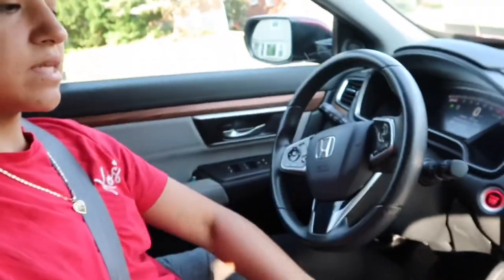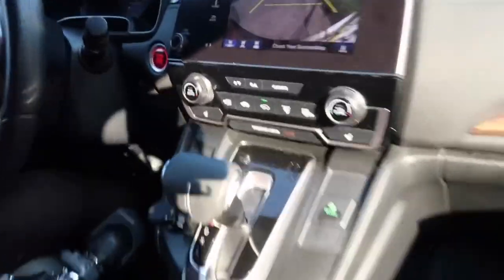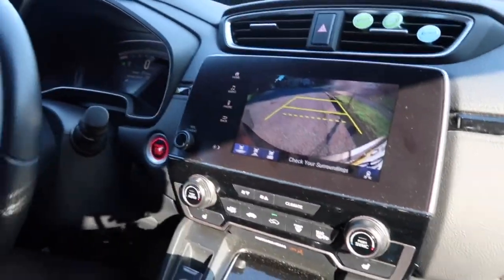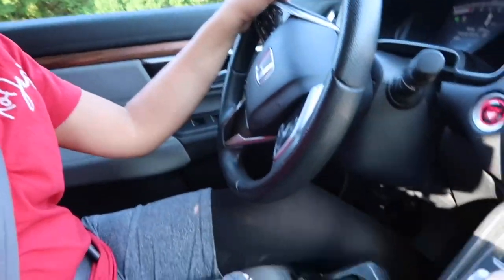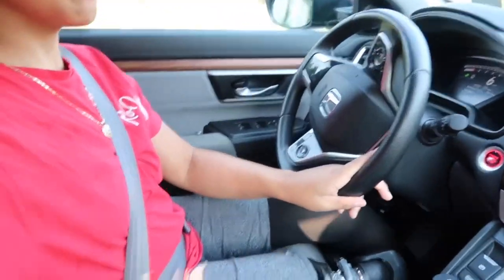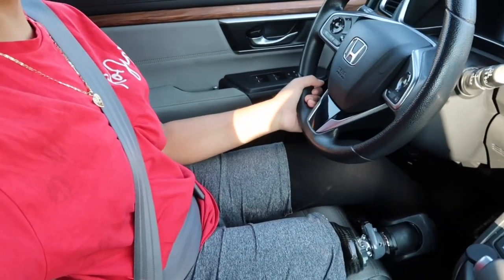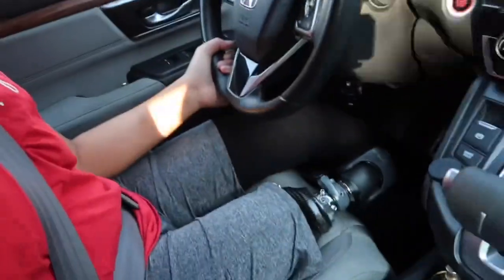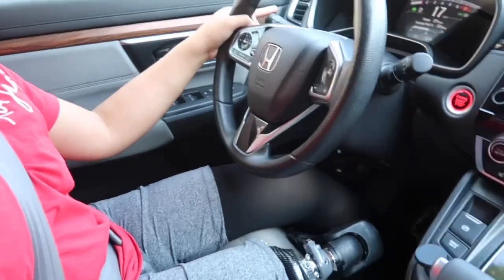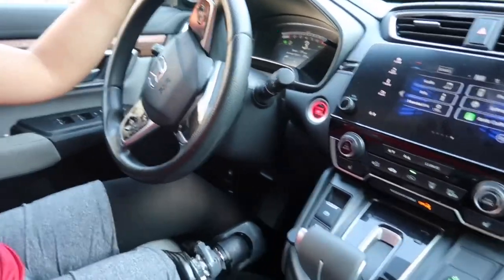All right, so here I go. I'm about to leave. Let me take the emergency brake off. Let me reverse a little bit. So you can see, guys, I drive regular, like if you would drive with your right leg. But the only difference is I drive with my left and I tuck in my prosthetic. Since I have the rotator, it's easier for me to just get it out of my way to drive.